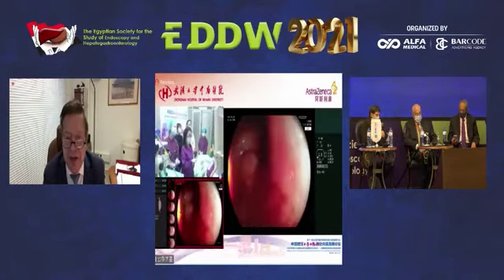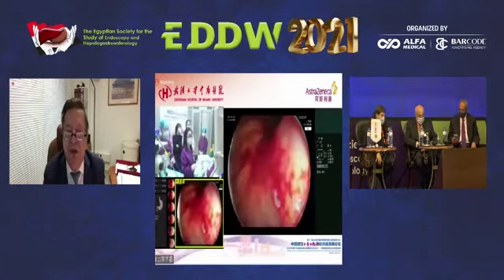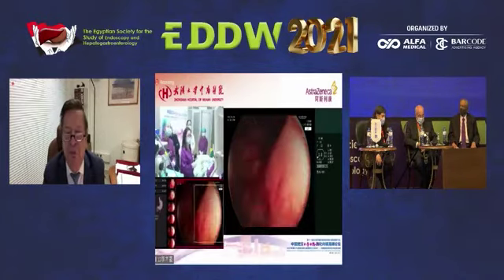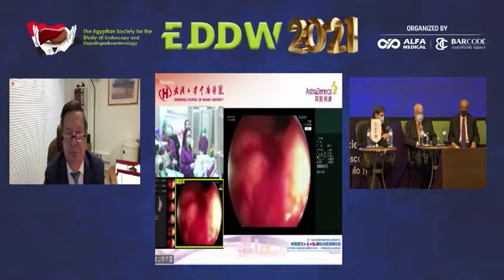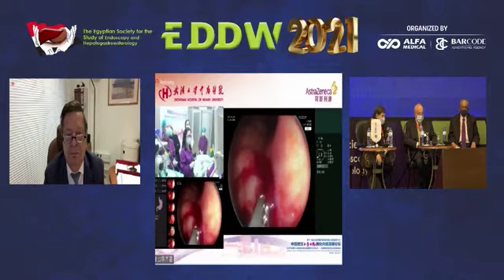For example, in some lesions, we do biopsy and later on we remove. In that case, using artificial intelligence, you detect, you characterize, and with characterization, if you think it's suitable for removing by endoscopy, you do ESD, and you send the total specimen to the pathologist, like a double surgeon.